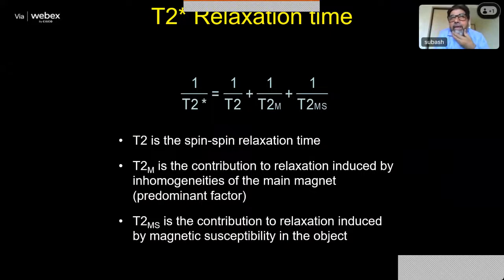If you are using gadolinium type paramagnetic ions, they reduce the T1 relaxation times to enhance the pathology. And if you are using superparamagnetic iron oxide materials, then they will reduce T2 relaxation times, and they are called positive contrast agents and negative contrast agents. So they do affect the relaxation times. That is the purpose of using contrast agents in MRI.